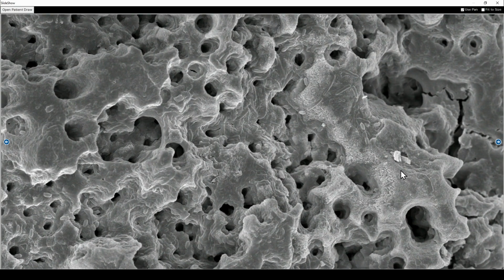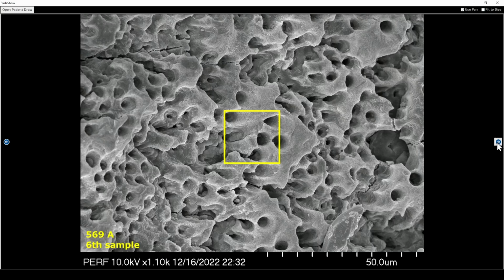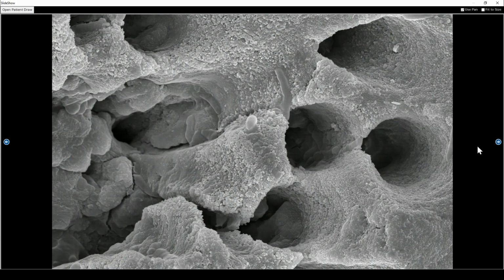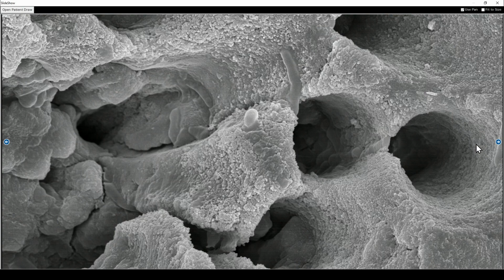And here you can see it. You have to look carefully. And in the Google group, when you look at the images, I've given you many, many different powers of images that you can use your scroll wheel, and you can zoom in like this and see if you can start to identify a bacterial biofilm signature.